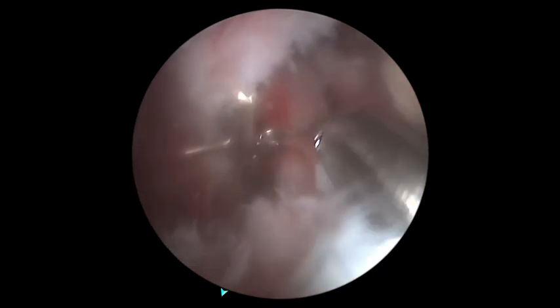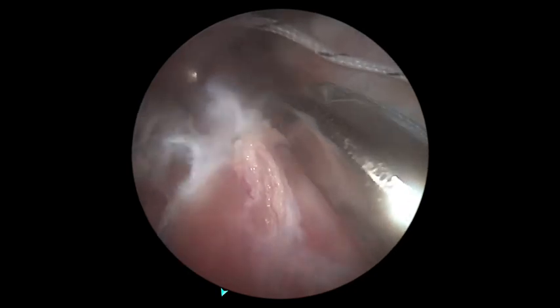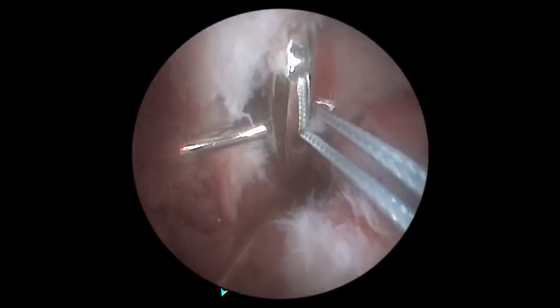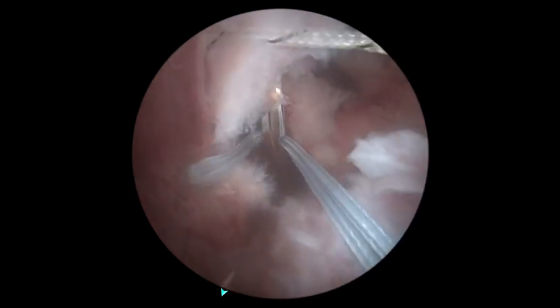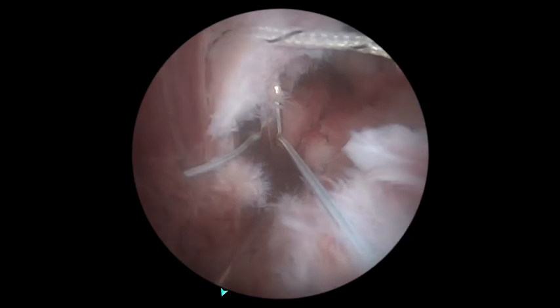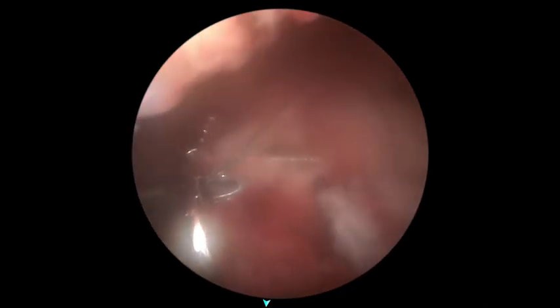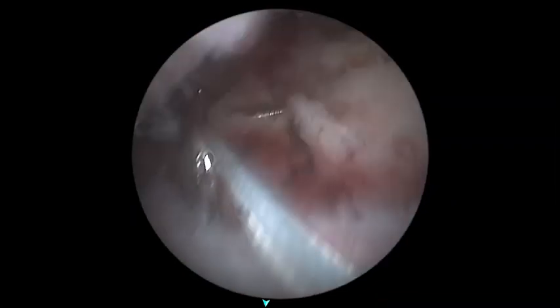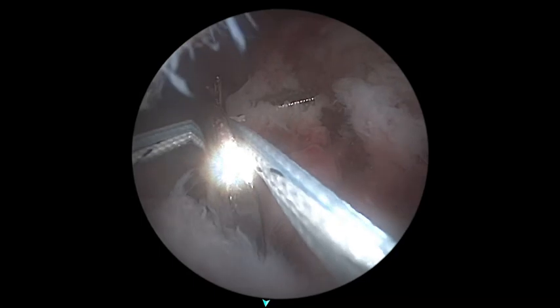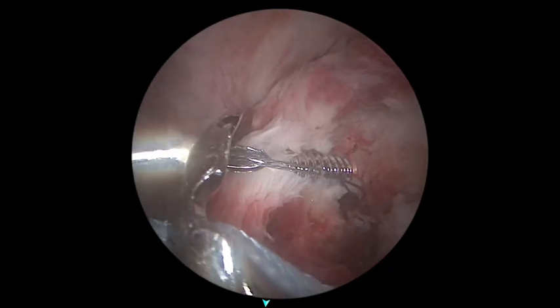We utilized the lateral portal and a suture passing device to thread the lasso through the existing holes and then subsequently pass heavy suture, starting with the most posterior hole that we were able to access, then the middle hole with 2 limbs of suture, and finally the anteriormost hole.